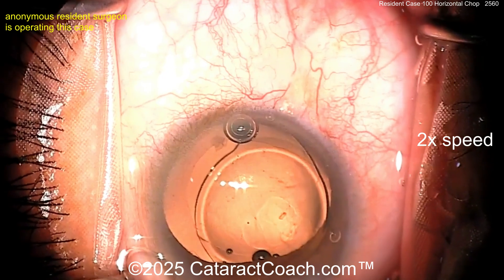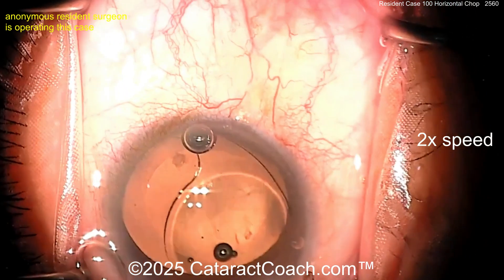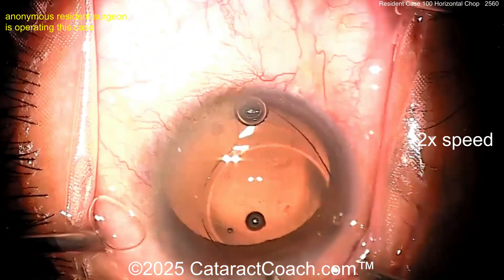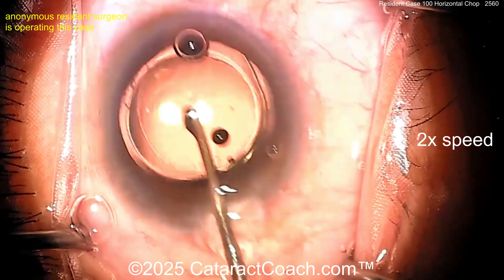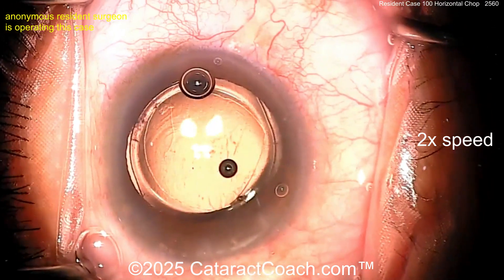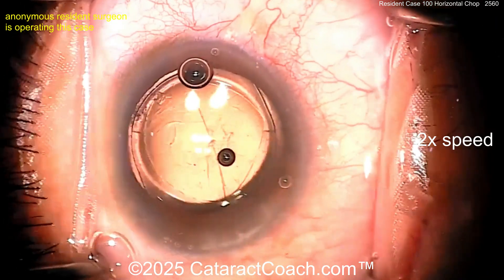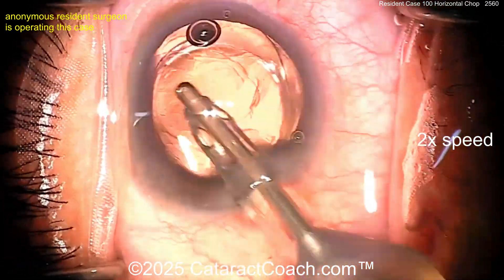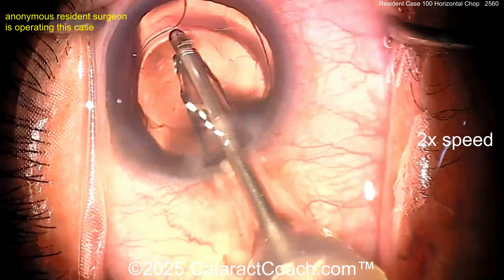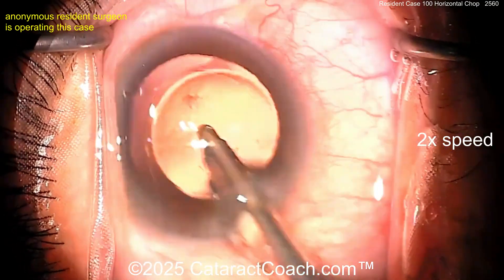Probably going to be a single-piece acrylic lens — let's see delivering it inside the bag. Looking pretty good. Get that thing in the bag, rotate it around — definitely make sure both haptics and the optic are within the capsular bag completely. You've got it in nicely. Look at the overlap — six-millimeter optic, that's definitely a five-millimeter rhexis. That's a beautiful job, really beautiful.